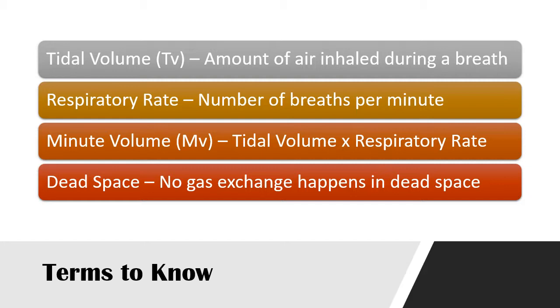We're going to get into that later. But tidal volume, importantly, for you to know right now, is the amount of air inhaled during a breath. Tidal volume is a function of your ideal body weight, which we're going to talk about later. Also with tidal volume comes exhaled tidal volume. You should know that when you're putting tidal volume in, you want it to come back out.